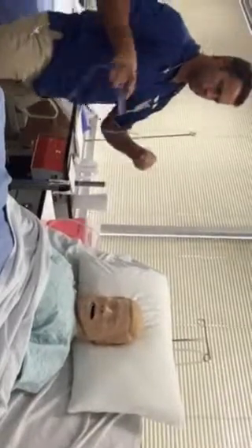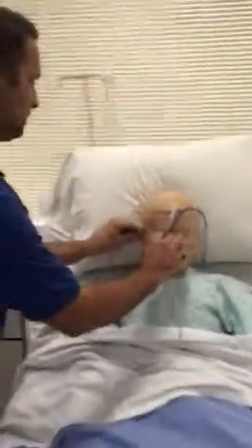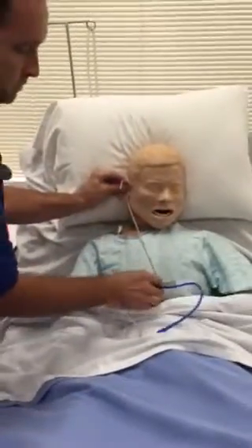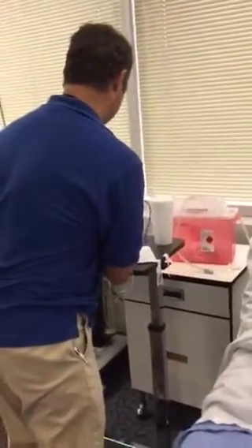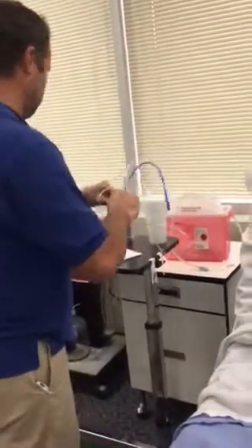Okay, here we go. Now we need to measure our NG tube. I'm going to go from the nose to around the ear to the xiphoid process. There's that. Right, to the xiphoid process, I'm going to mark that with a piece of tape.